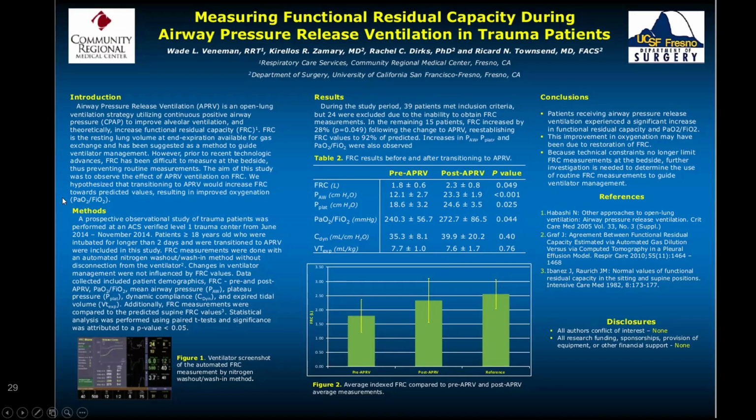Now, this was an abstract poster presentation that we did back in 2015 at the AARC in Tampa. And what we were looking at was when we're using it downtown for trauma patients. One of the biggest questions I keep asking is, if you recruit the lung, you increase FRC, but how do you prove that? How do you actually demonstrate that we increase FRC? In the old days with our old GE ventilators, for those guys that have been around, we were able to measure FRC at the bedside.